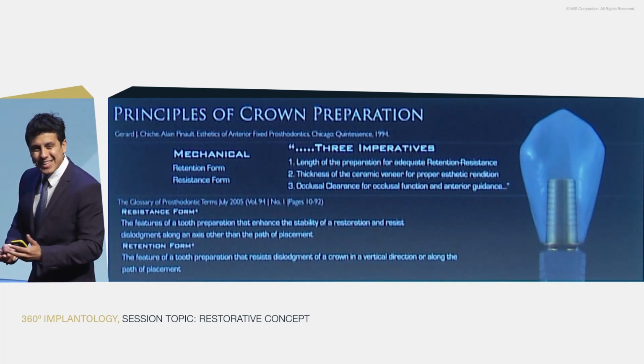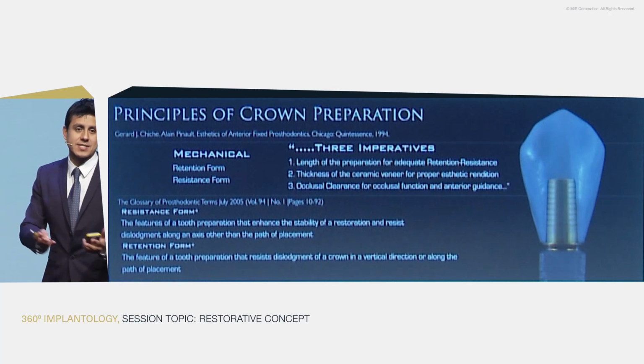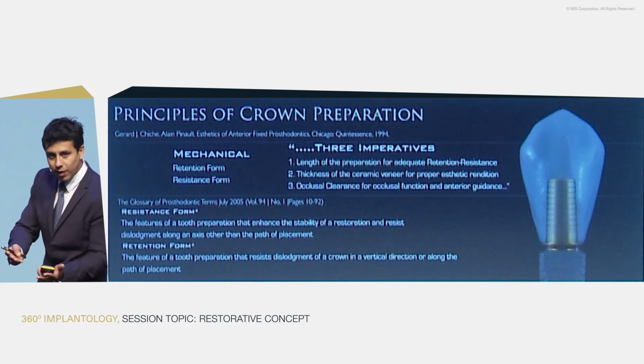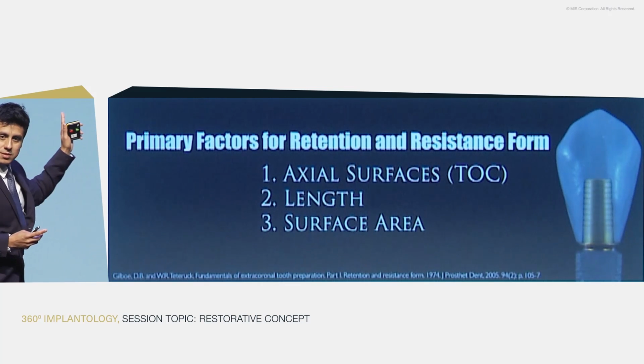So if we don't have adhesion between the zirconia or the disilicate with the metal, we have to go back to the basics. We have to think that our tie base with our zirconia crowns, we have to go back to the basics and think in 3 topics.